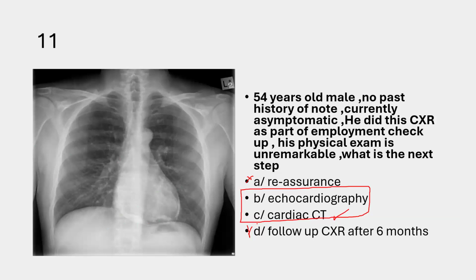But is this the information I'm looking for? Or am I looking to know whether this patient has constrictive pericarditis by echo or not? He is not clinically symptomatic, but echo might reveal the physiology of constriction, and in this case, I might operate even in the absence of symptoms.